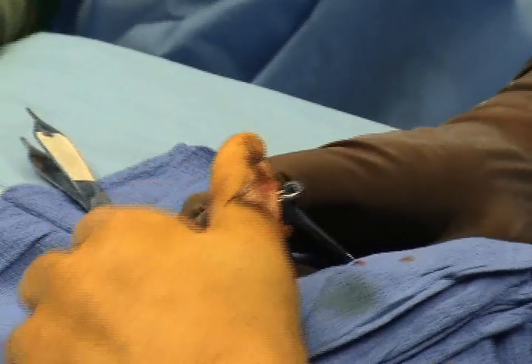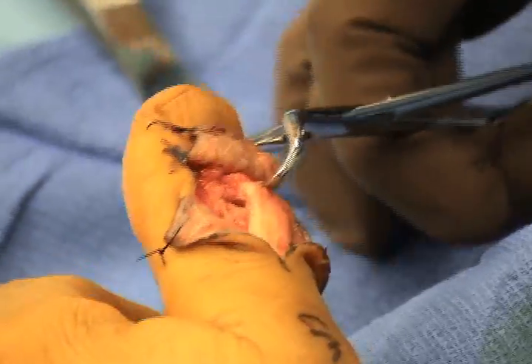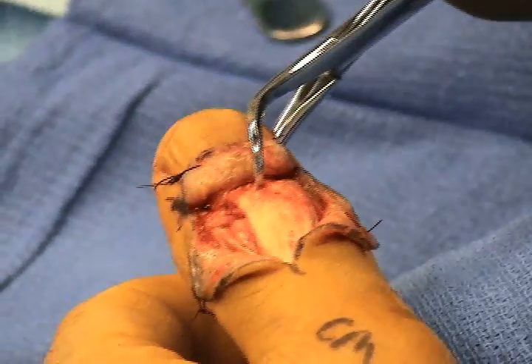This is confirmed under fluoroscopy and stabilized with a bone reduction clamp. Once anatomic reduction has been performed, internal fixation can be accomplished.